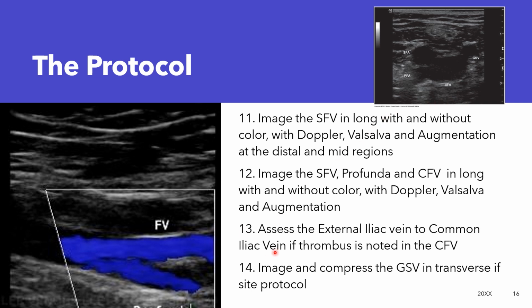You'll evaluate that popliteal, following it up in long until you see it jump from the back of the leg more to the side of the leg. At that point, the vein is passing through the adductor canal, and you'll want to put your patient back supine, leg out, so that you can access that inner thigh.